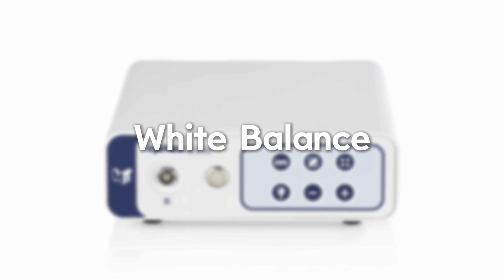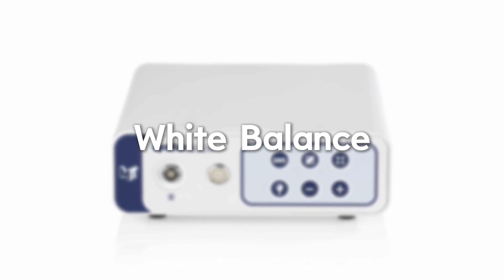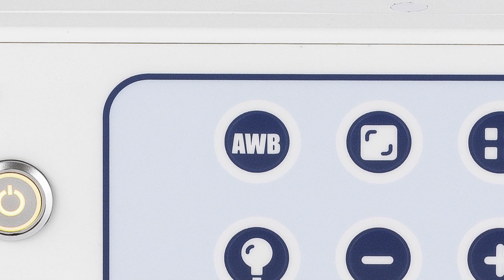To white balance, point the distal tip of the scope directly in front of or around a white non-reflective surface. Press the AWB button on the IMAX controller. The prompts on the screen — white balancing and white balance done — will be displayed. The scope is now ready for use.